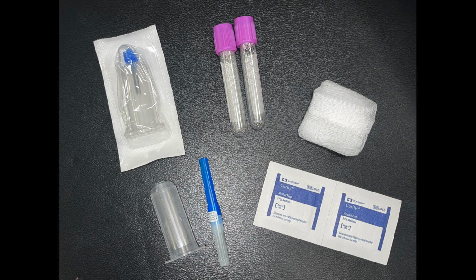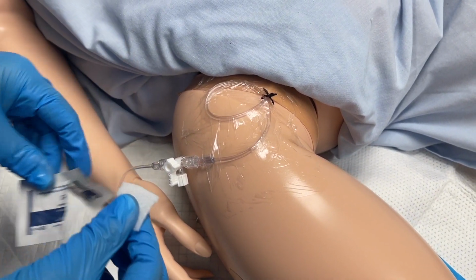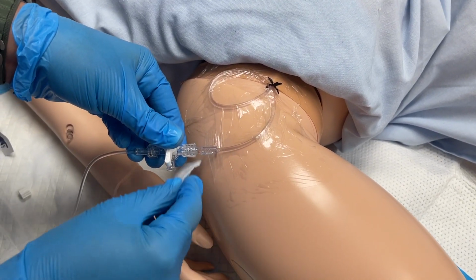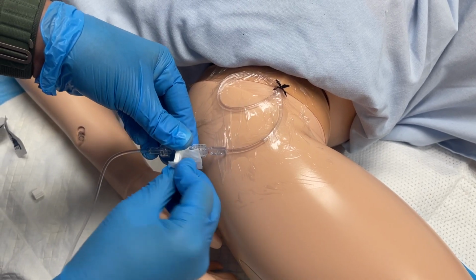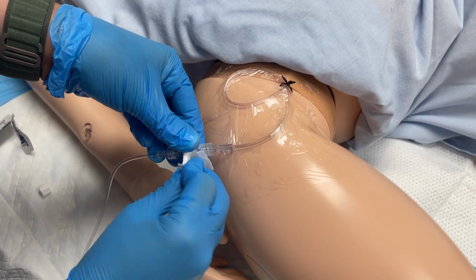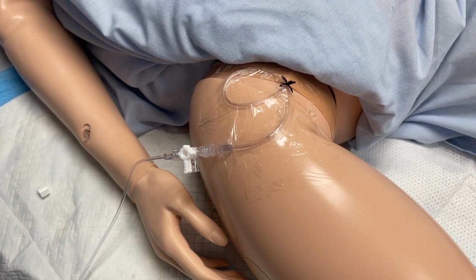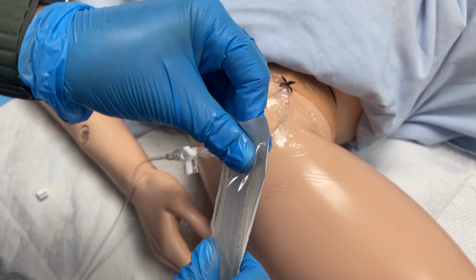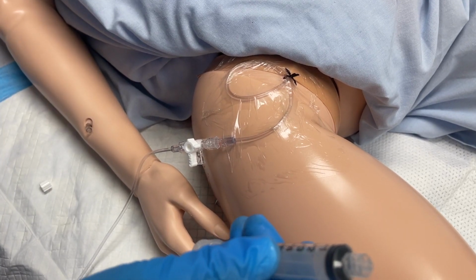Beginning with the arterial line we have already reviewed, we will use the stopcock closest to the patient's access site. If we've been using the line to monitor, the stopcock will be off to the air. Uncap the port and cleanse it with the appropriate solution. Since the line is primed with saline all the way down to the access site, we will need to waste the first little bit of blood.